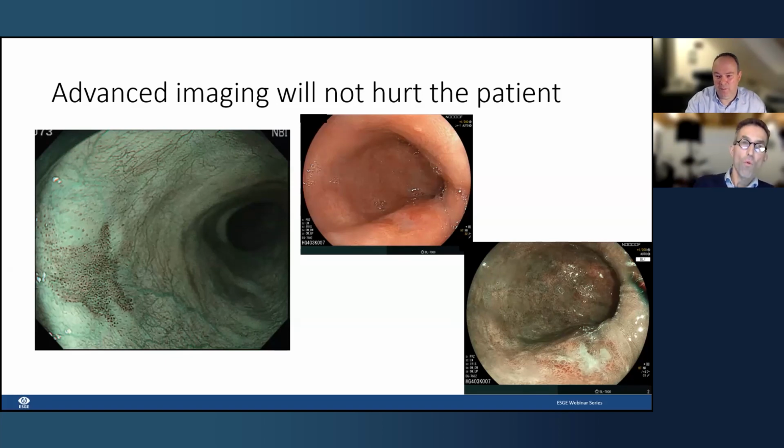Yeah, exactly. One other short remark is that Khalida mentions that she always takes pictures of the duodenal bulb when she just enters the bulb, because otherwise you have to re-enter it again, and that might increase the discomfort of the endoscopy.